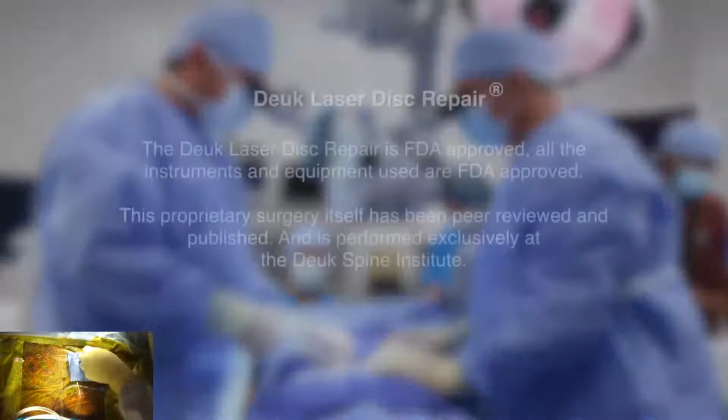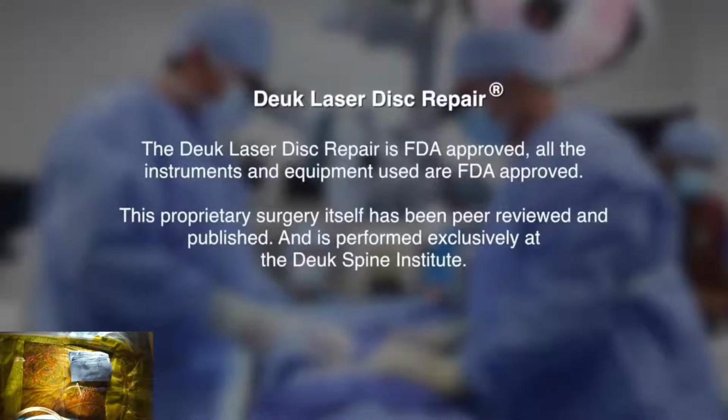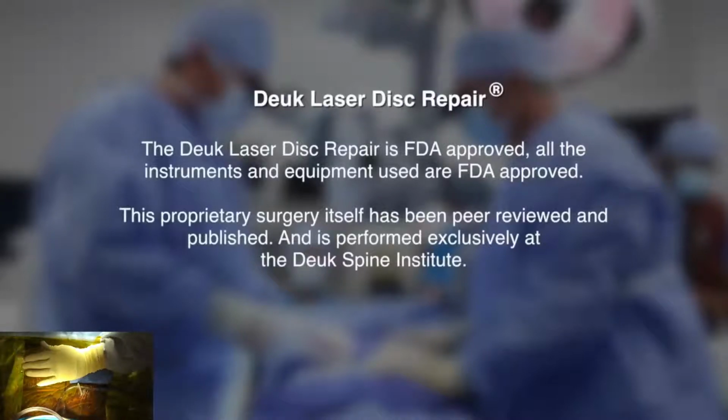The Deuk laser disc repair is FDA approved. All the instruments and equipment used are FDA approved. This proprietary surgery itself has been peer-reviewed and published and is performed exclusively at the Deuk Spine Institute.